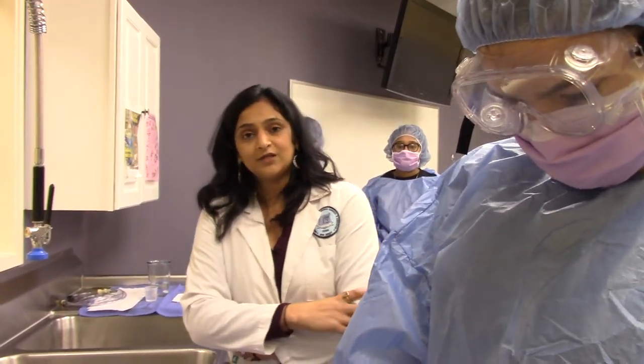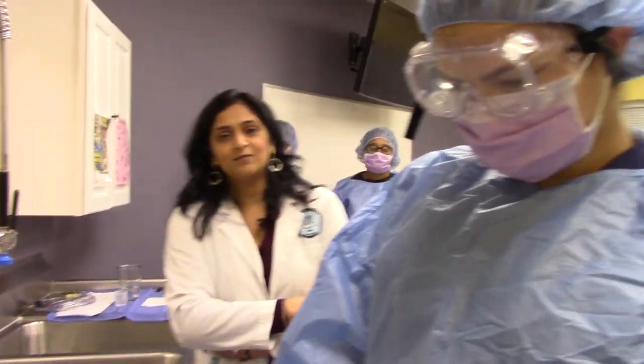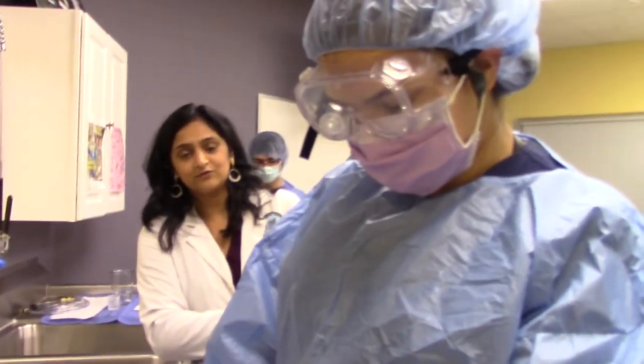In this class, we're going to do the manual cleaning for the flexible endoscope. Here is my whole team: Gio, Kayla, and Amanda. Amanda is going to do the reprocessing for the scope.